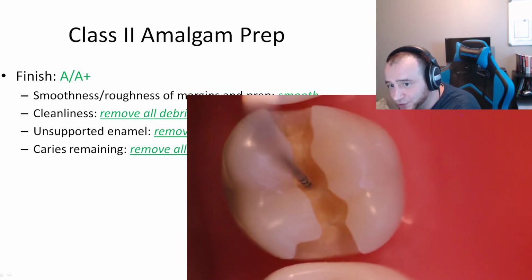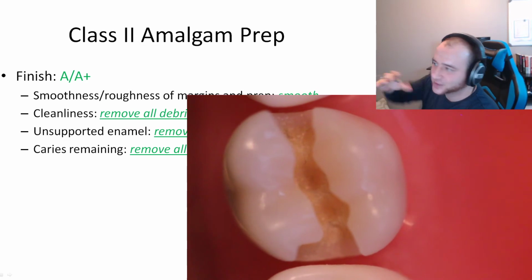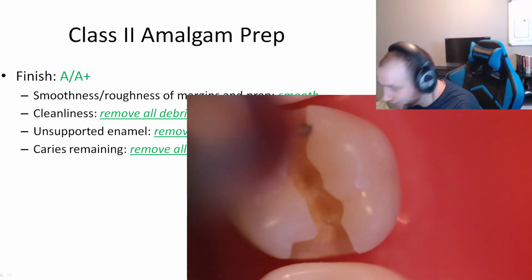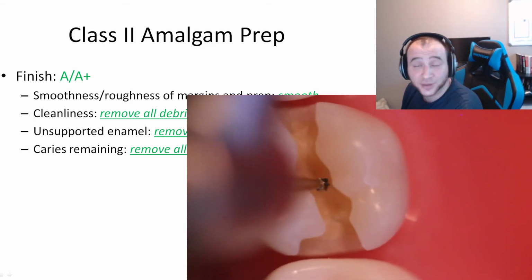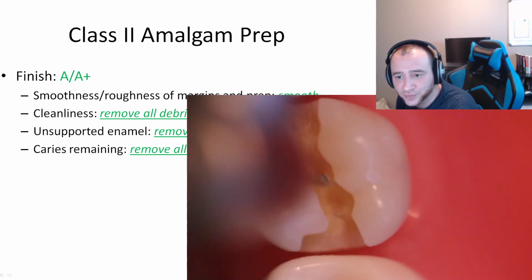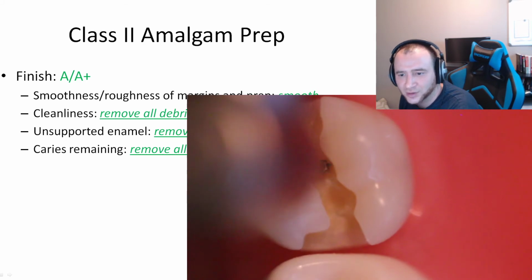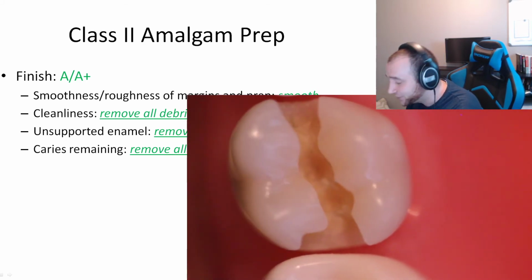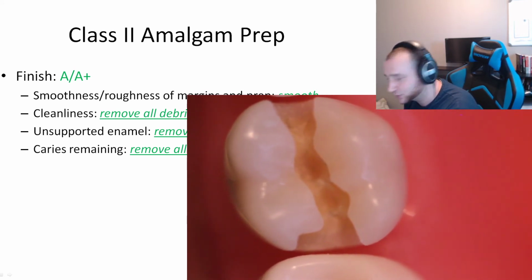this elevation. There's some sort of weird temptation while you're removing caries to flatten it all, right? You might start to feel that you want to flatten this area. Like you don't like it. Why is it there? I'm used to having a flat pulpal floor. So you might have this temptation while you're removing this and removing this to flatten this area as well. But you shouldn't. Just be careful. You want to leave that. That's your evidence that you did the prep properly in the first place, right? So you want to leave those areas.